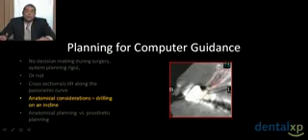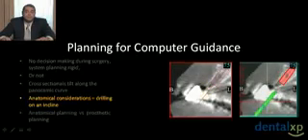Now, there are other anatomical considerations when we're clinically using these types of systems. What if we're placing an implant into an area where we're encountering an incline or a narrow ridge? Remember, there's the possibility, although these systems are somewhat rigid, for that implant to deflect off that palatal incline or incline of bone and then traverse, it could be a half a millimeter. That may not sound like a large amount, but we know that with implant dentistry, a half a millimeter can make all the difference in the world, whether it be for aesthetic positioning or positioning the implant within bone. So again, we can't do these procedures blindly.